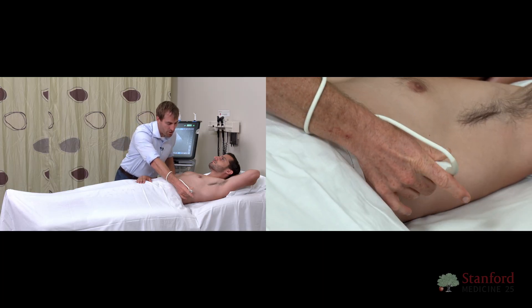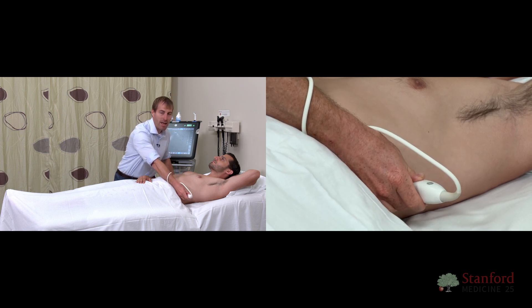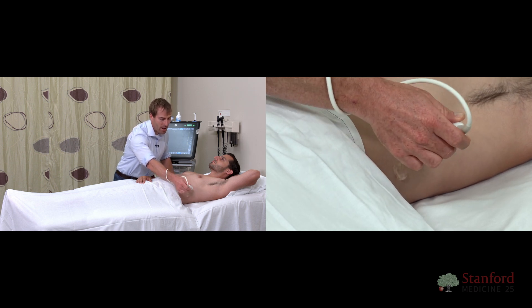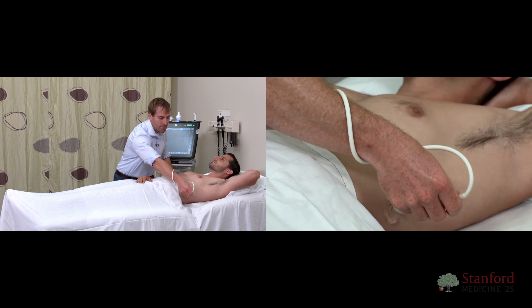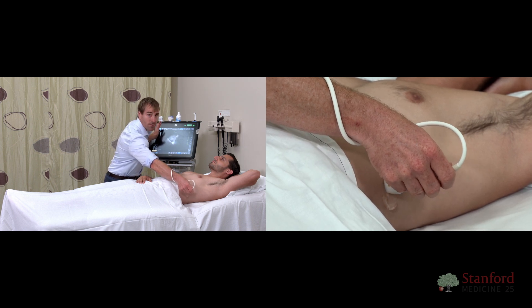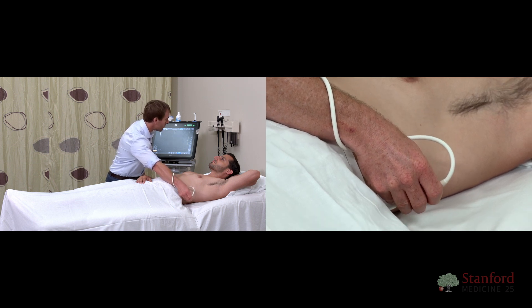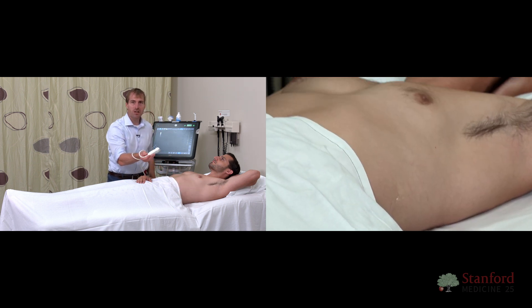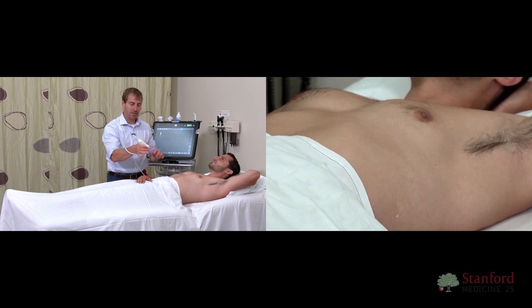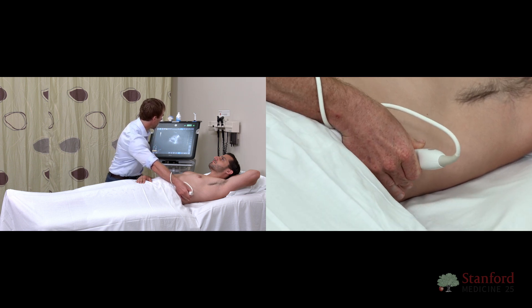When you go to apply the probe to your patient, place it on them and notice your hand — put the whole side of your hand against their side so it doesn't go anywhere. A lot of people when they start out hold the probe back here and don't touch the patient. Their attention is on the screen, and the next thing you know the whole thing has moved because the gel is really slippery and you don't know you've moved. So hold it like a pencil, put your hand against the patient like so, and now you can get a nice, clear picture.